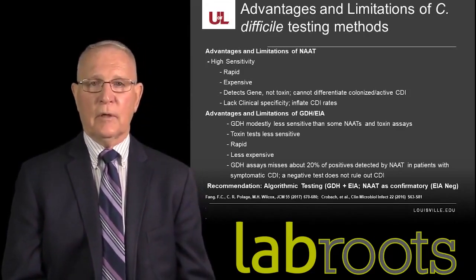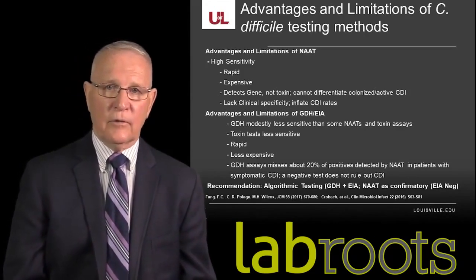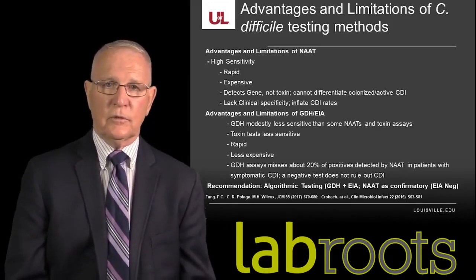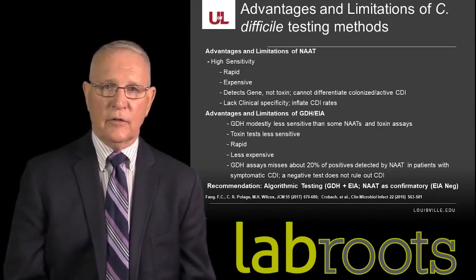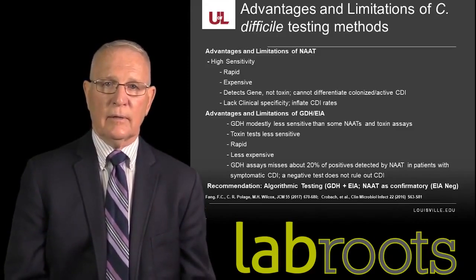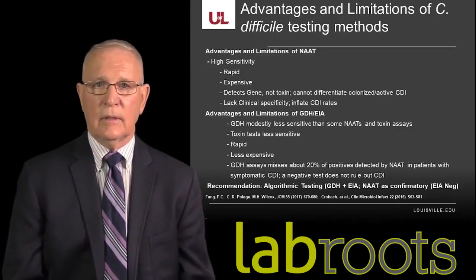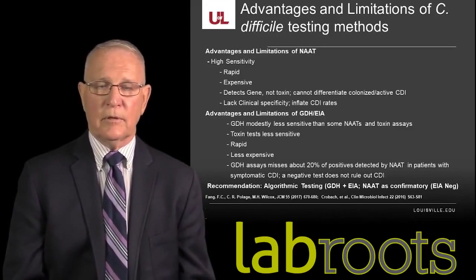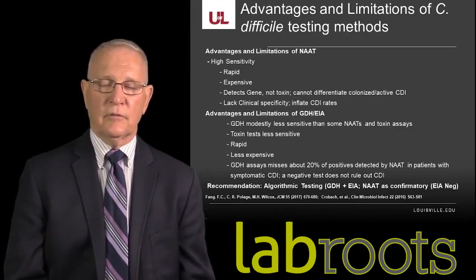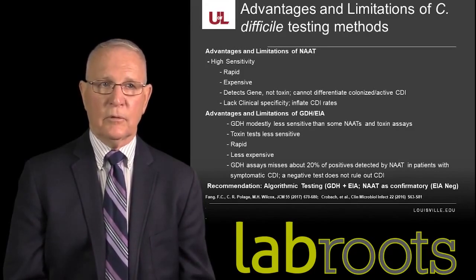If a patient's been on a laxative for the last 48 hours, the test is not performed. The specimen is not eligible. Have they had an antibiotic history in the last 2 weeks? Criteria like that are currently acceptable, but certainly we are in need of a more formal definition of the clinical aspects of the infection as well as the laboratory definition.